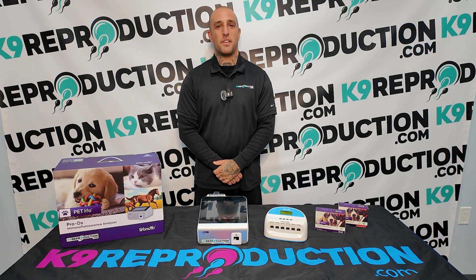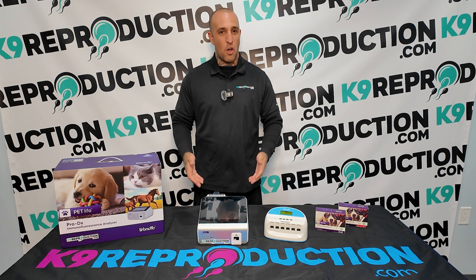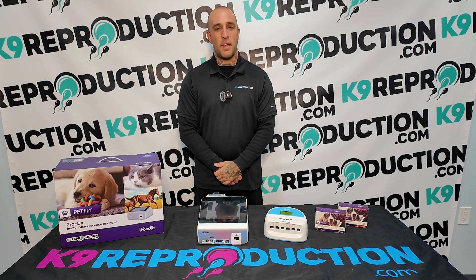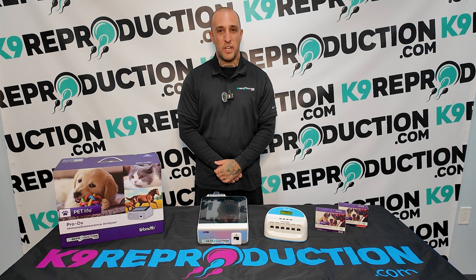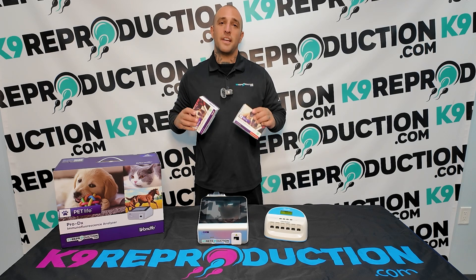Hello, I'm Travis with K9Reproduction.com. Today I'm going to walk you through the process of using the Wondfo Pro-DX Canine Progesterone Analyzer. This video is all about the step-by-step process to ensure you get accurate and reliable results every time, whether you're using serum or whole blood tests.